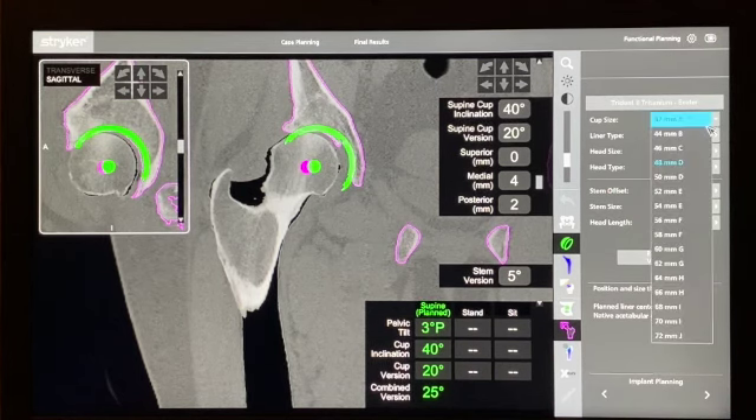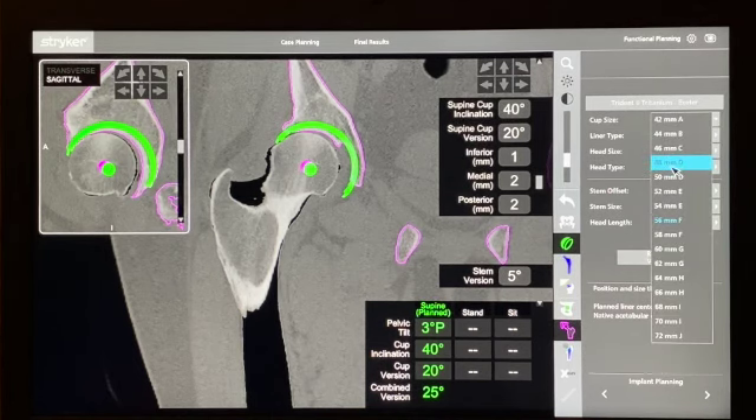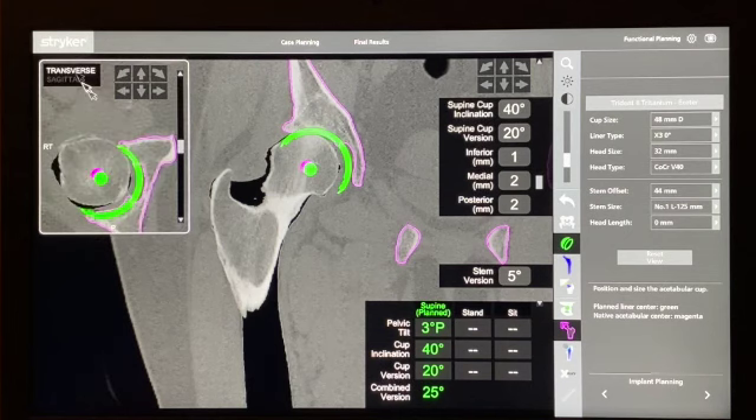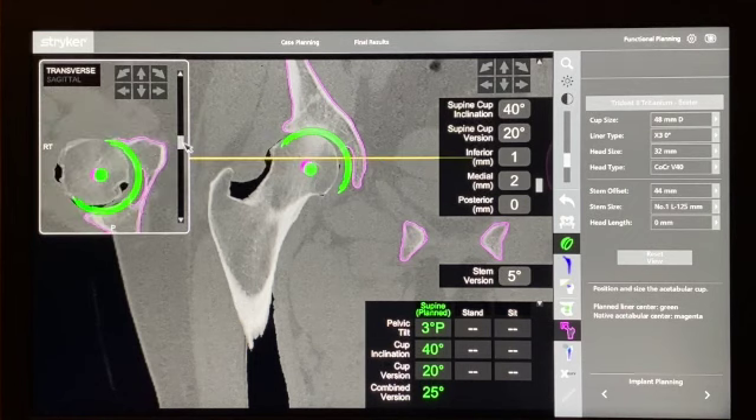We can change the size of the cup, move it around, inferiorize it, or lateralize it — the idea is to find something that will work for this patient. This cup is much too big, so I'm going to downsize it. I like to look at the transverse view and try to line up the two standard rotations roughly in place. We're centred in the femoral head with about half of the acetabular component through bone, which is a pretty good size. Inclination is set at 40 degrees and cup version at 20.